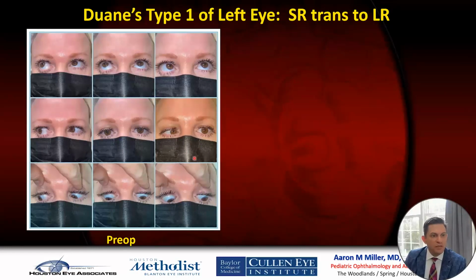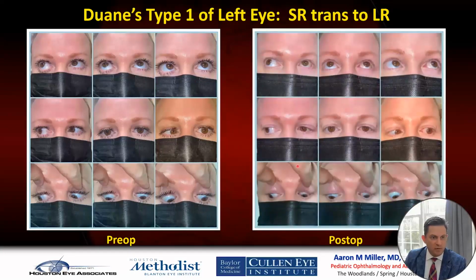So she had this procedure, which involved the isolated transposition, and there is the decision of whether to augment it with the medial rectus recession or just recess. Actually, she had the medial rectus recessed also. But you can see in this picture that the recession of the medial rectus combined with this augmentation improves things. This is what's unique about this procedure: you actually get increased abduction.